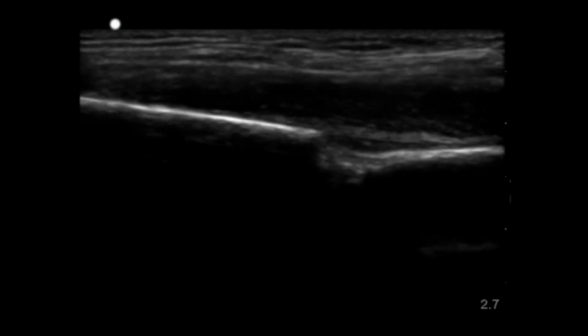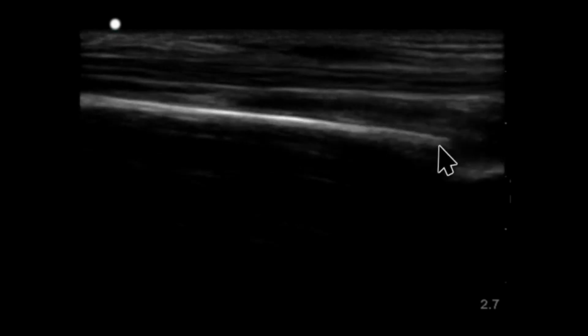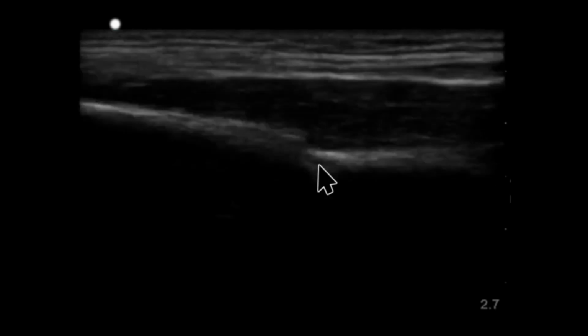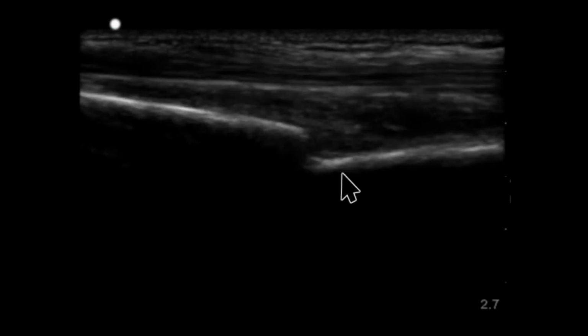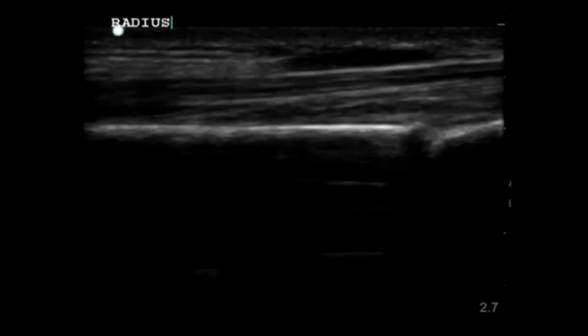Fracture reduction is again illustrated here. Here's one bone end, and here's the other bone end. Care providers are getting to the other bone end here and trying to bring these two bone ends as close as possible so they line up and have the same angle. Now this is all performed under ultrasound guidance. Try to watch these bone ends come back together.